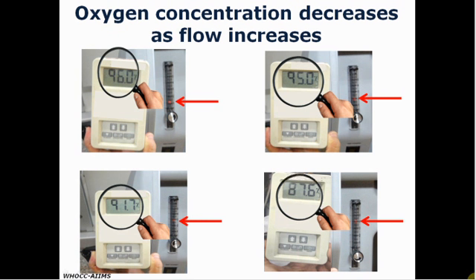It may not be a major problem with current oxygen concentrators, which can achieve the oxygen concentration of nearly 96 to 97%. When a flow splitter is being used, the total flow should not exceed more than 5 liters, else the concentration of oxygen will decrease. This happens because the canisters have a defined volume and can only separate a known volume of nitrogen at a given time.